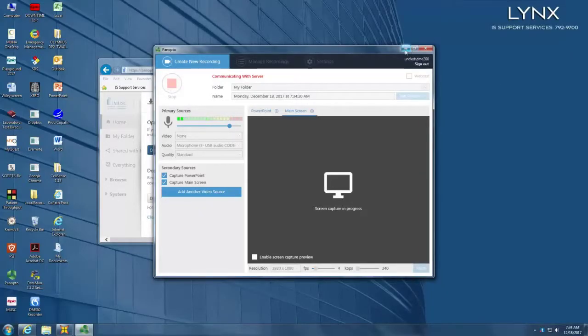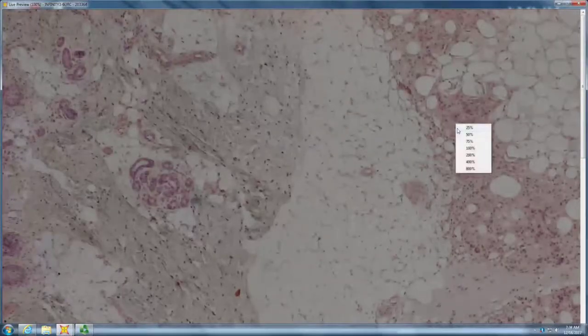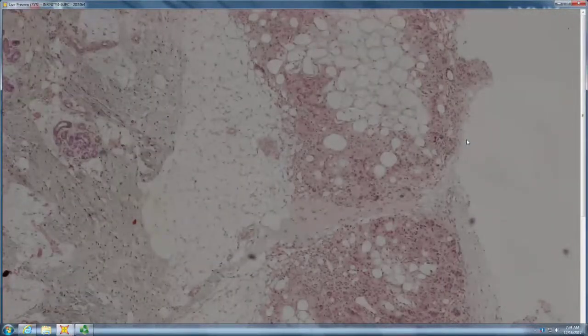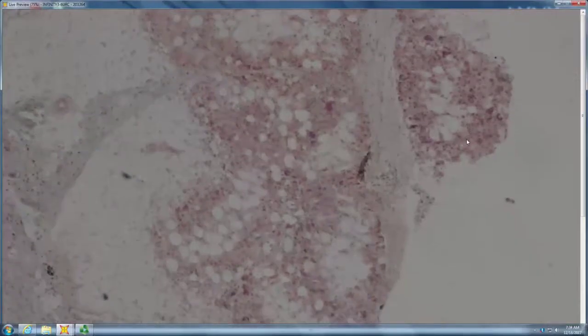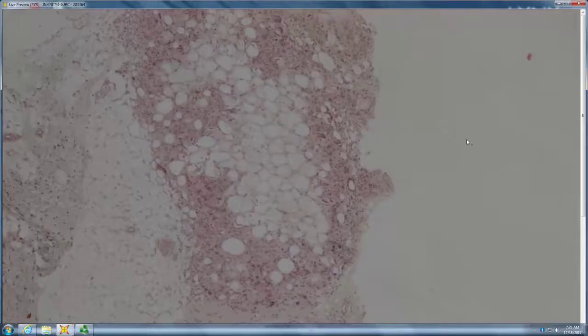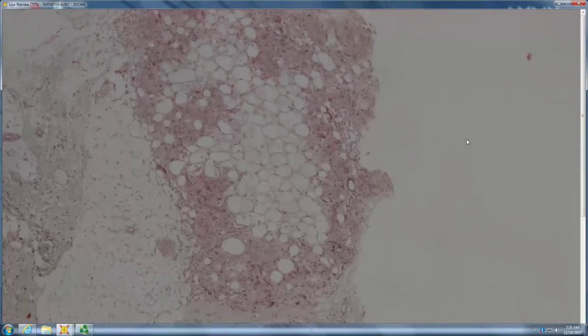Okay, so I believe we are up and running here. Let's start with our first one here. It may shock you, but the changes are in the subcutaneous fat. Let me make sure we're in focus for the screen first.